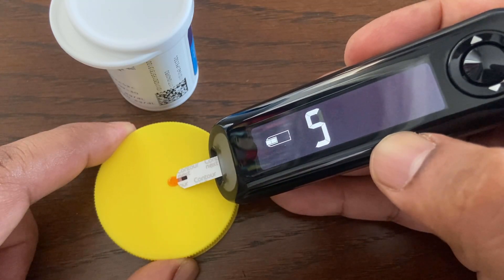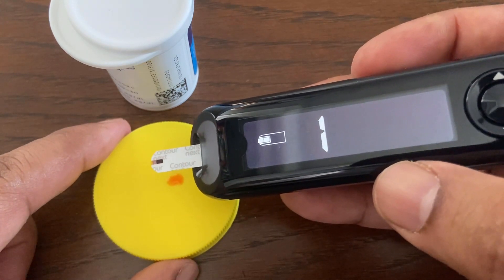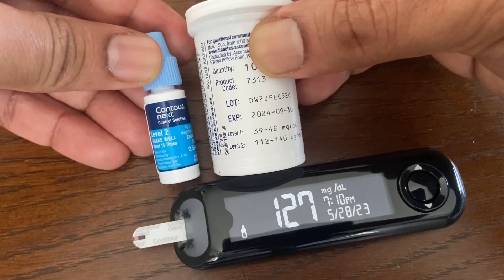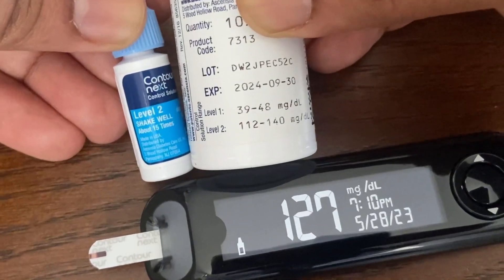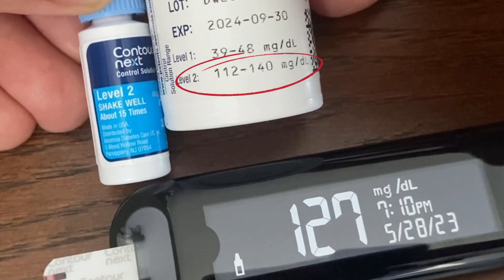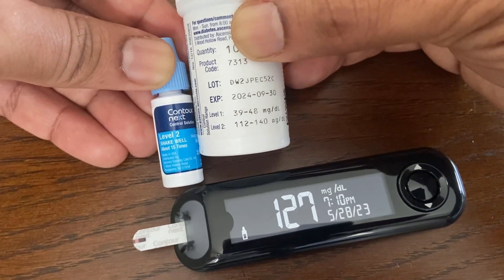The meter counts down for 5 seconds before displaying the control test result. The meter automatically marks the result as a control test. Compare the control test result with the range printed on the test strip bottle or bottom of the test strip box. In this case, the control solution is level 2 and the reading obtained is within the range for level 2 on the test strip bottle.